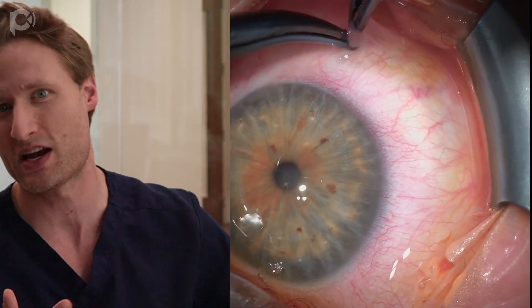Even more commonly, you may be operating on somebody who has their natural lens but the cornea is so bad and so cloudy that it makes IOL calculations impossible, or it makes the phaco component of the surgery really challenging because it's tough to see into the eye to do the operation. So for these reasons, you may want to clear the cornea up first before trying to do anything with the lens. Phacic DMEC is therefore an important type of DMEC surgery to be comfortable with, and there are a few tips that may make that operation simpler.